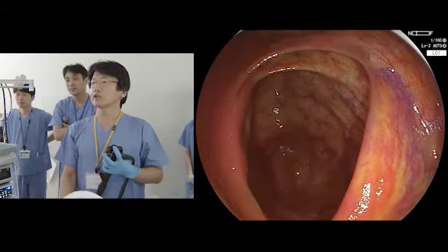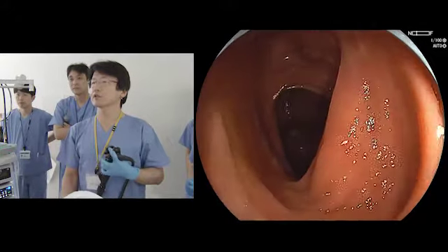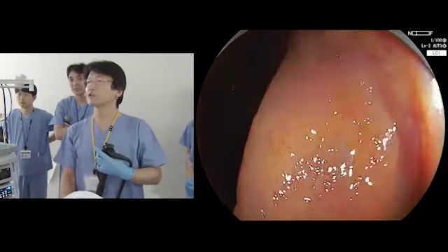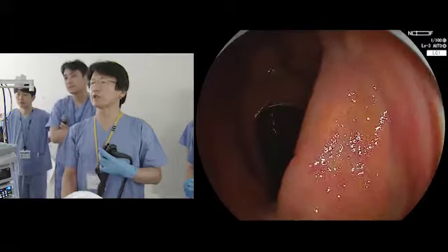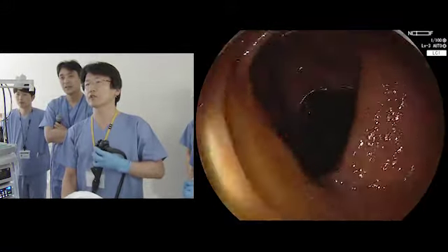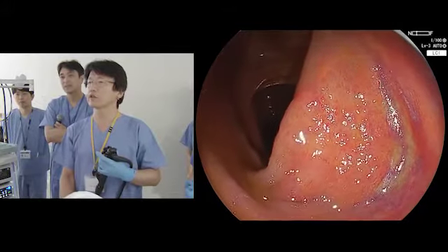And this is a lesion which cannot be seen very well with white light. Here is the lesion, but the lesion is not well seen. And this is LCI. Still, it's not very clear, but a little bit easier to recognize. And this is one lesion. And the other lesion which was introduced is here. And today I want to show you the ESD technique on this lesion.